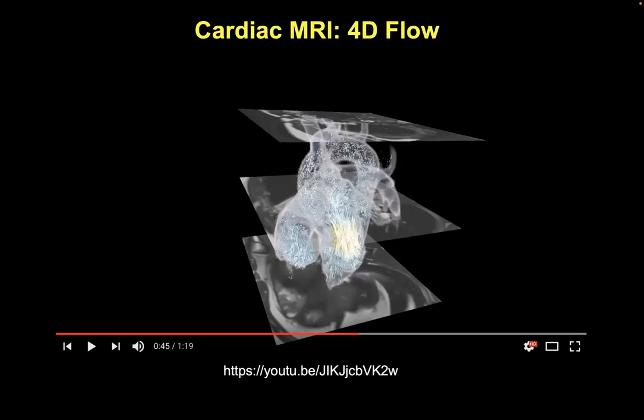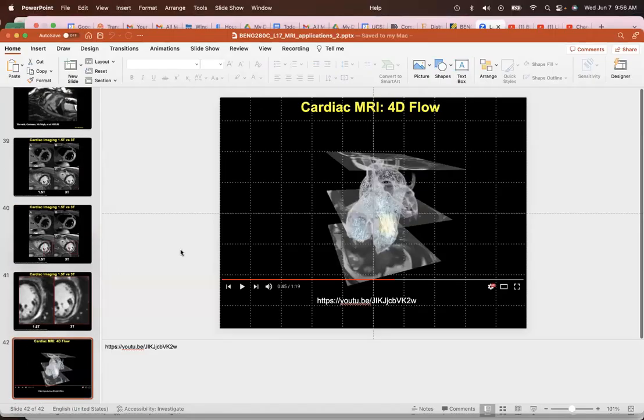The problem is the market isn't that big. So the manufacturers have put a lot of time and money into interventional MR. I don't fault them, but the medical market itself is pretty hard to break into when you're saying, hey, you should do this with a much more expensive piece of machinery, and with a staff that is highly specialized, right? Yeah, they have to set up a whole new kind of room. Very complicated, very expensive proposition.